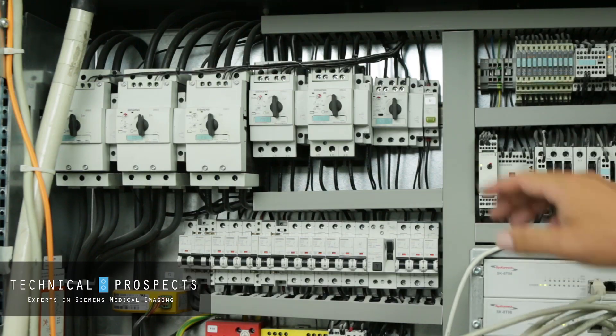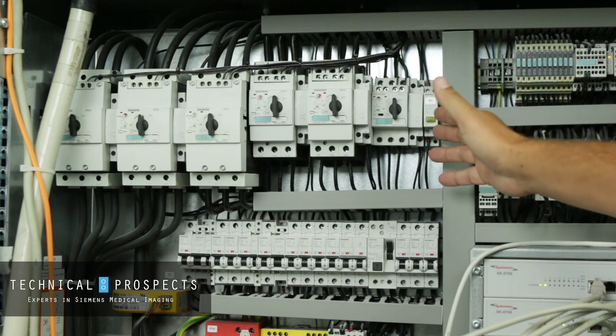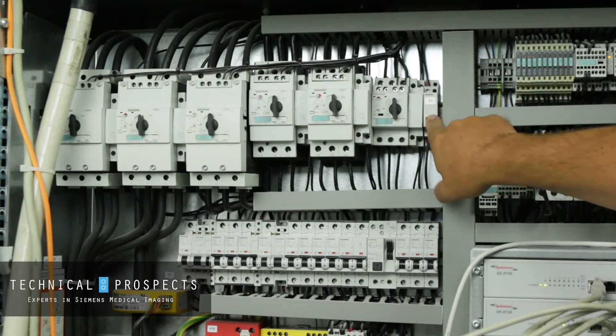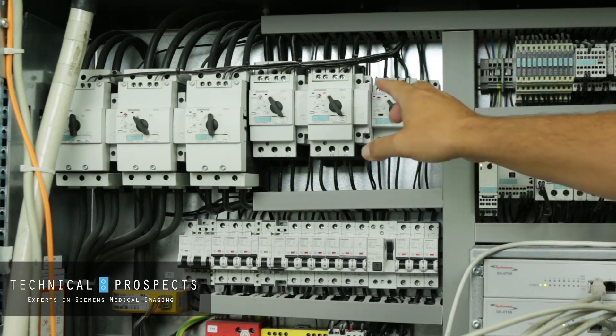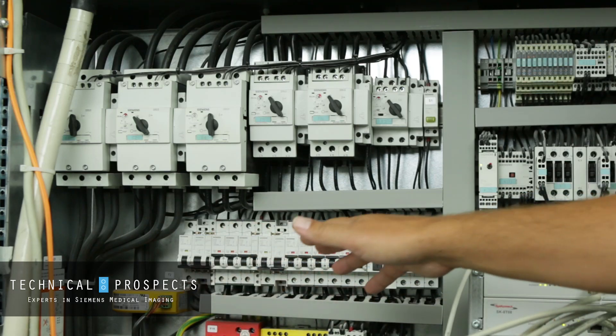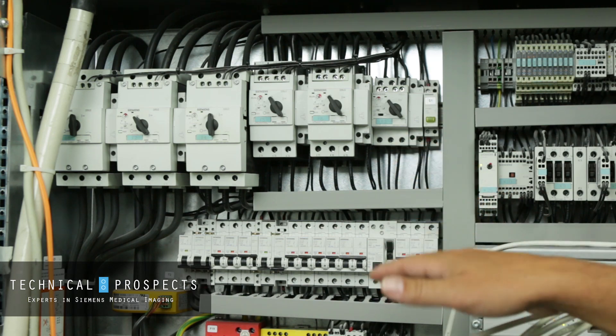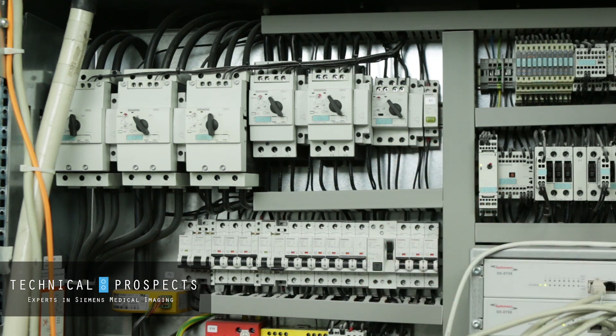The next thing you're going to want to do is hit this S1 switch here — this is the service switch button. Once you hit this, you'll notice multiple breaker assemblies and also these breaker switches down here have turned off. At this point, all power has been removed from the gantry so you can do your preventive maintenance, parts replacements, or service troubleshooting activities.